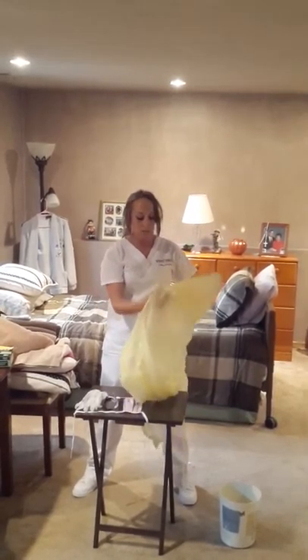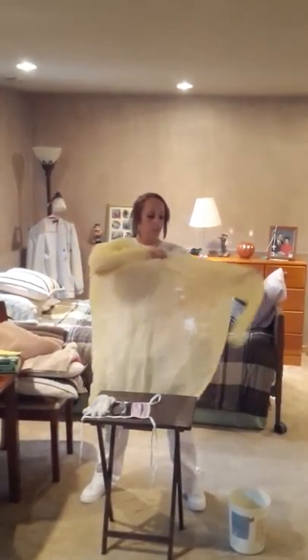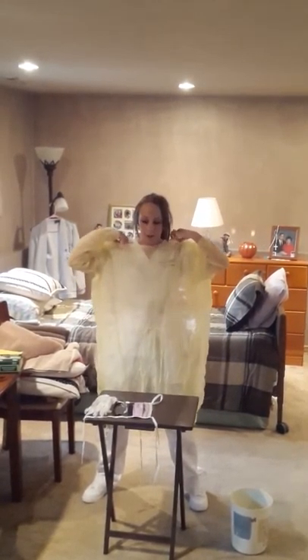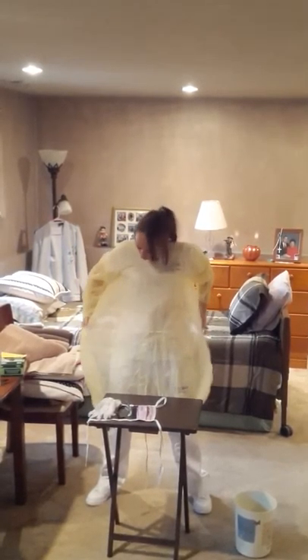Next I'm going to put on my gown. If the gown is too small, you can use two gowns, putting one on backwards like a robe and then another one on over top of it.